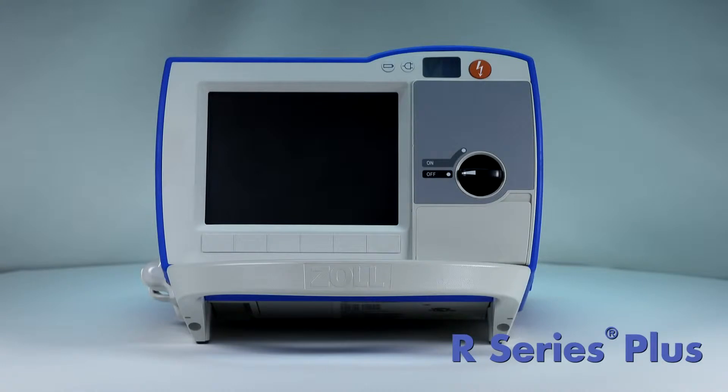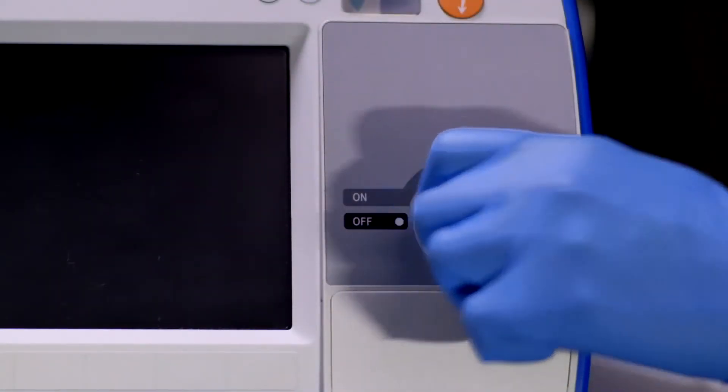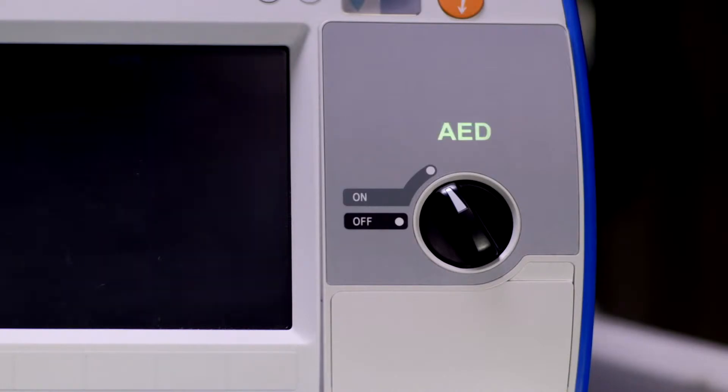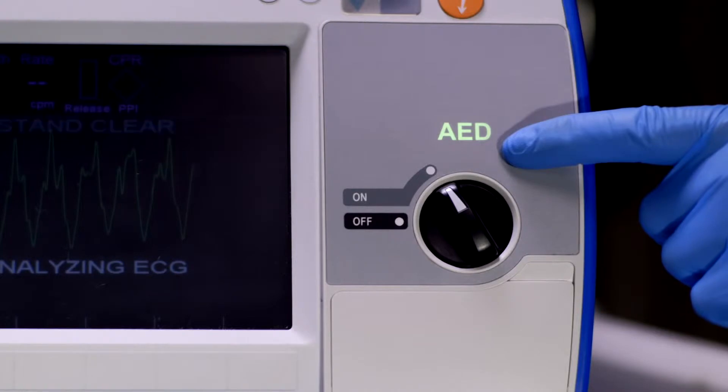The R Series Plus is a fully functional manual defibrillator that powers on as an AED. To begin, turn the mode selector to ON. You will notice that the defibrillator says AED.